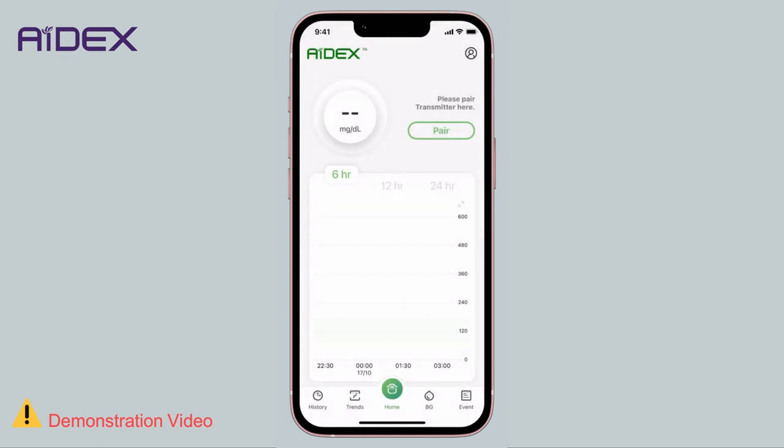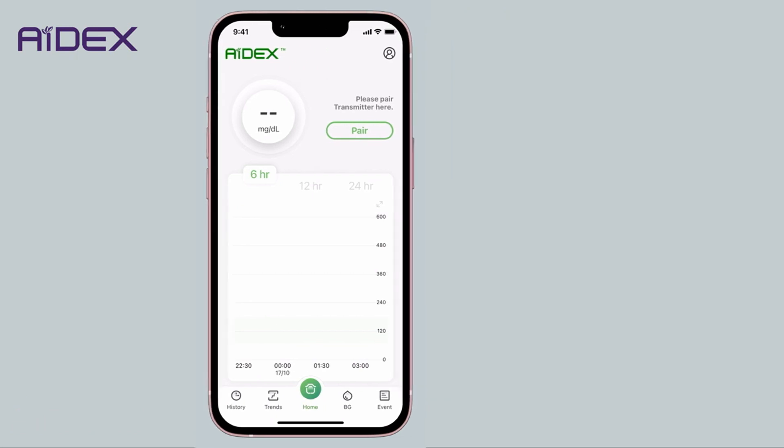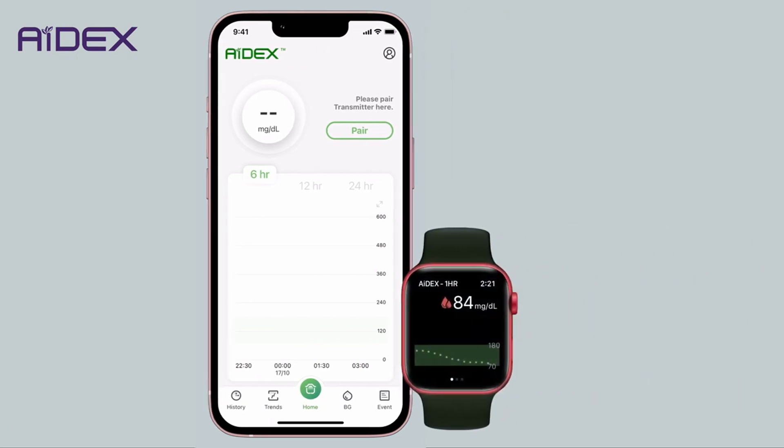And now we've finished the installation on your mobile device. Additionally, you can also install the app on your smartwatch.